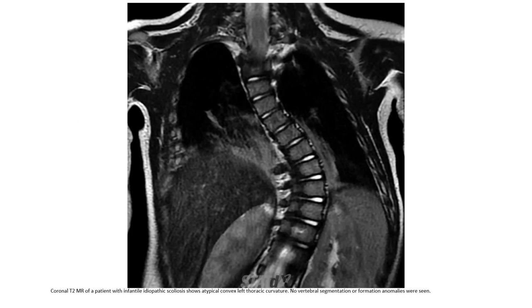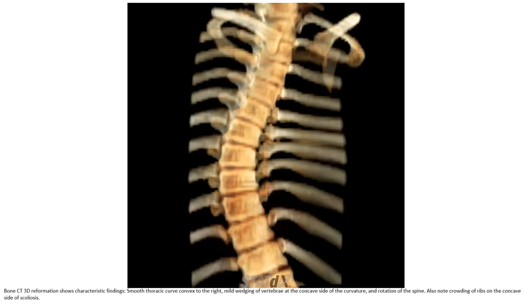T2 MRI of a patient with infantile idiopathic scoliosis shows atypical convex. There is left thoracic curvature with no vertebral segmentation or formation anomalies. Bone CT reconstruction. The characteristic finding is a smooth thoracic curve convex to the right, mild wedging of the vertebrae at the concave side of the curvature, rotation of the spine, and crowding of the ribs on the concave side of the scoliosis.